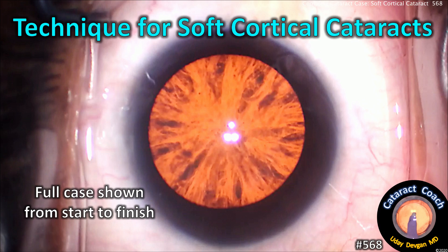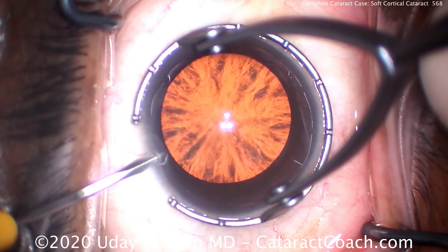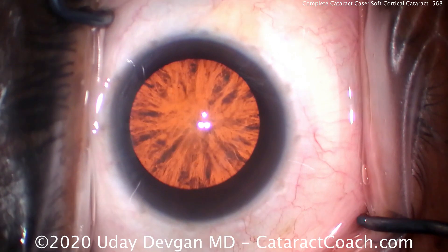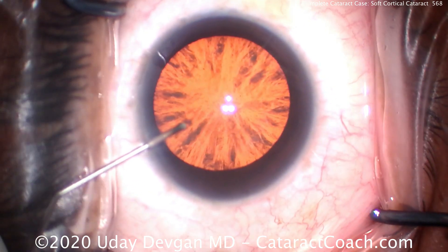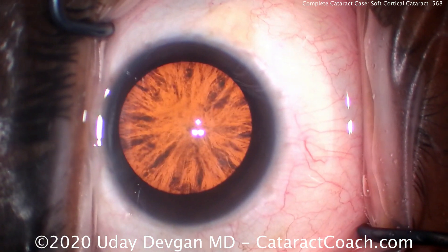CataractCoach.com — technique for soft cortical cataracts. We'll show you the full case from start to finish. This patient has a lot of cortical spoking and cortical opacities, causing him tremendous glare with sunlight, oncoming car headlights — everything. He's having a very difficult time functioning. Certainly he needs cataract surgery.